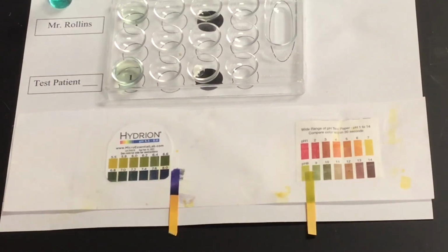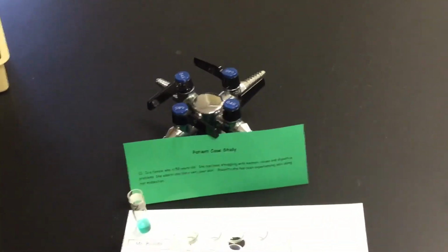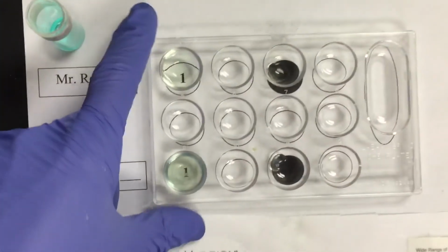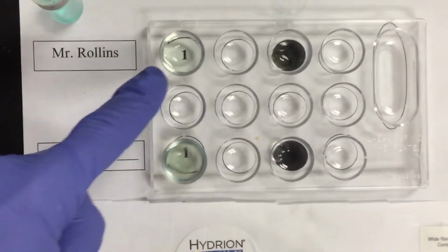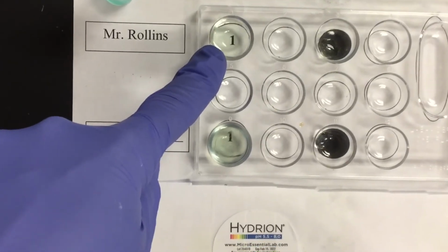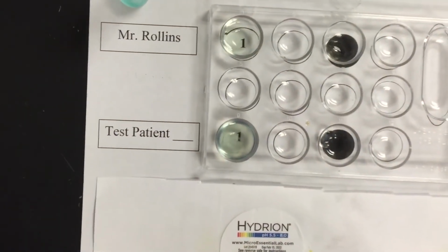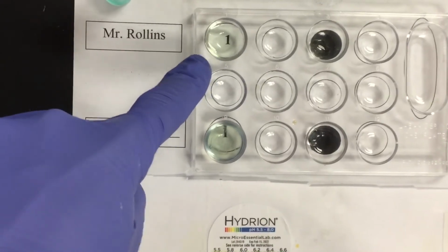While we're waiting for it, we're going to take a look at the rest of our sample, specifically protein as well as chlorides. Across the top, you have Rollins's urine, and well number 1, just like what we did with our control patient the other day in the video and in class, is for protein. We've taken 10 drops of urine and added 5 drops of biuret solution. In order for it to be positive, it would turn a pink, purplish color. So we know Rollins, being that control patient, is negative for protein.